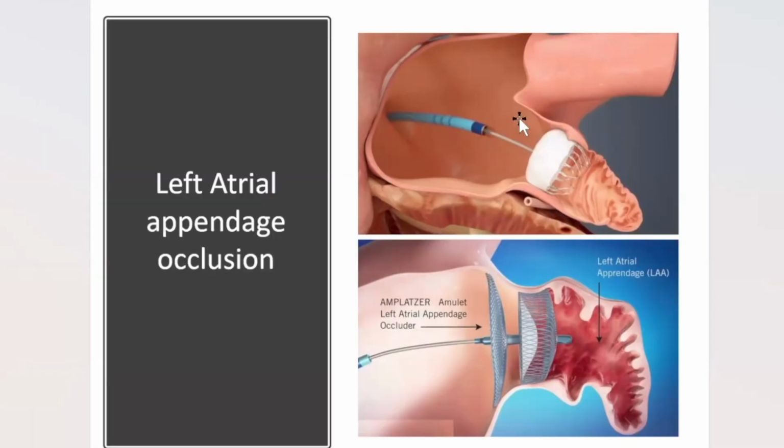And we're one of the few centers, if not the only or one of very few Canadian centers where we can do an ablation and put one of these devices in the same procedure. And where that's important is that most of the risk of the procedure is getting you on the table, putting you under general anesthetic, and getting the catheter in the left atrium. Well, we're already there if we do the ablation.